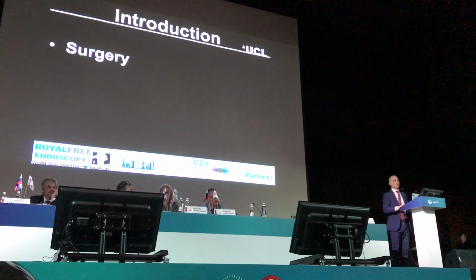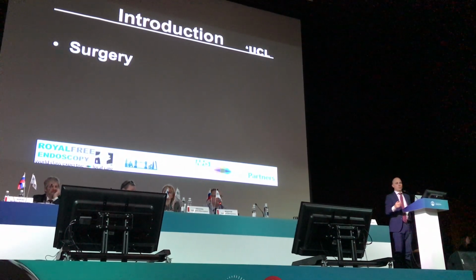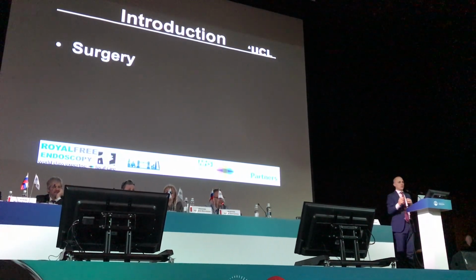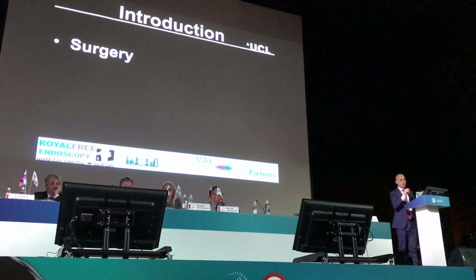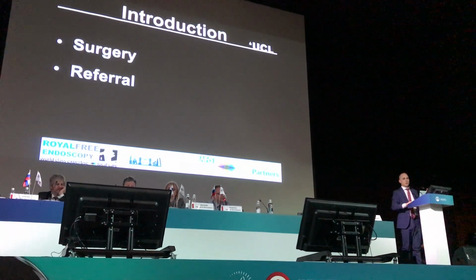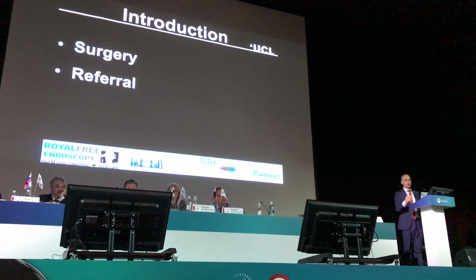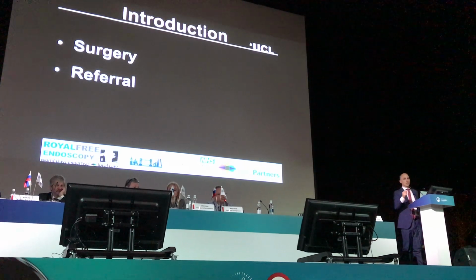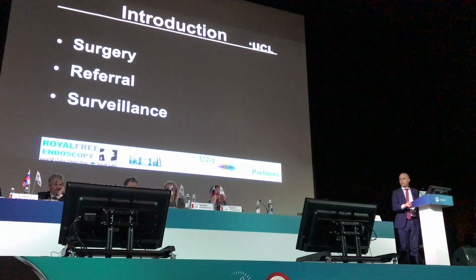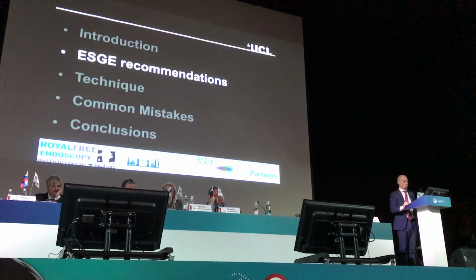So cancer, because we want to send the patient for surgery and we need to allow our surgeon to perform a good resection, not too large, but very precise resection, possibly laparoscopy. Otherwise, when we encounter a lesion in the colon or small bowel that we are not able to resect, we can tattoo and refer to another endoscopy center, or we can resect ourselves and then place a tattoo as surveillance for the future to check where the lesion was.